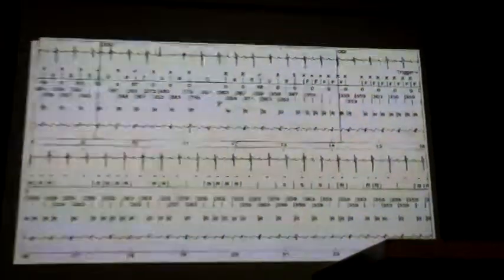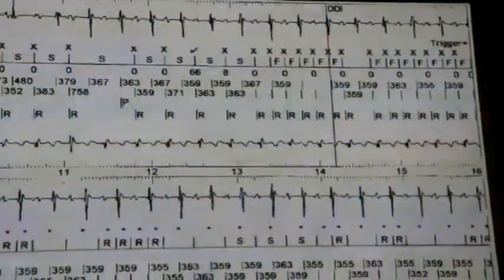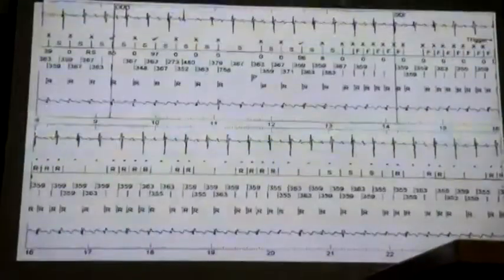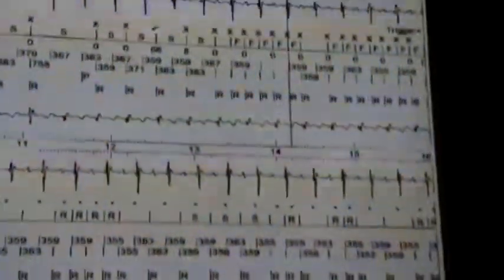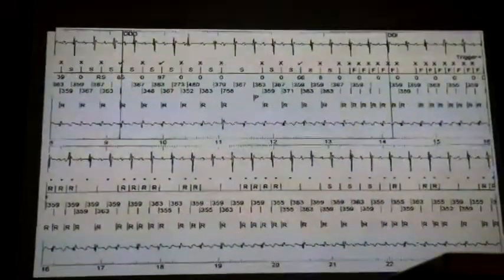But it is sensing in here. It's just not classified that RR interval. There's a mismatch between the average and the actual. Either X is a non-match, 0 is the score. Yeah, 0 is the score. So we were kind of worried about this guy.